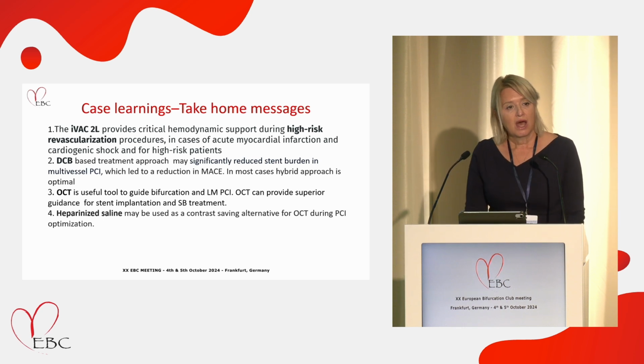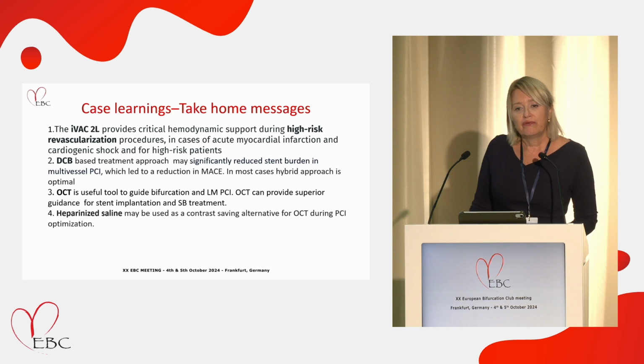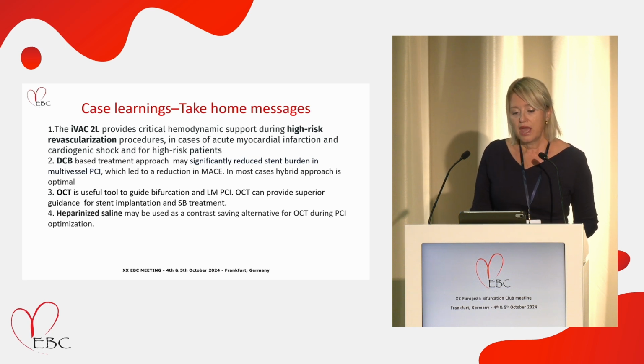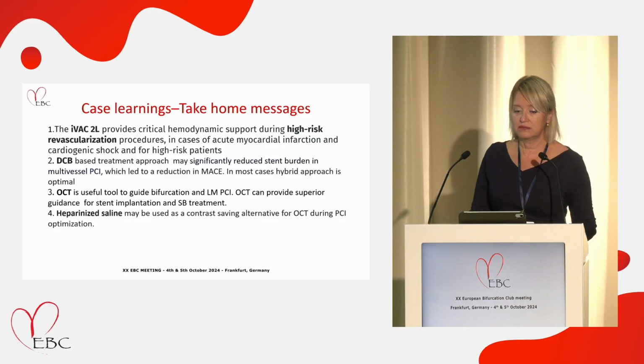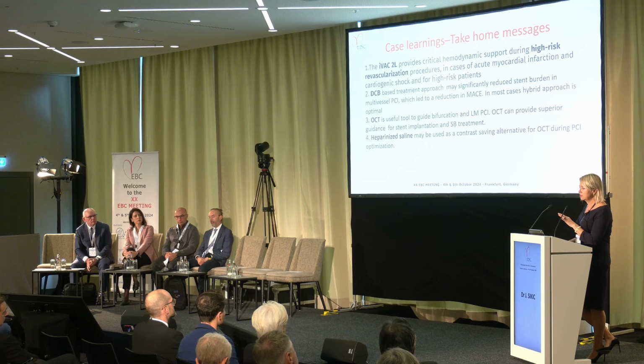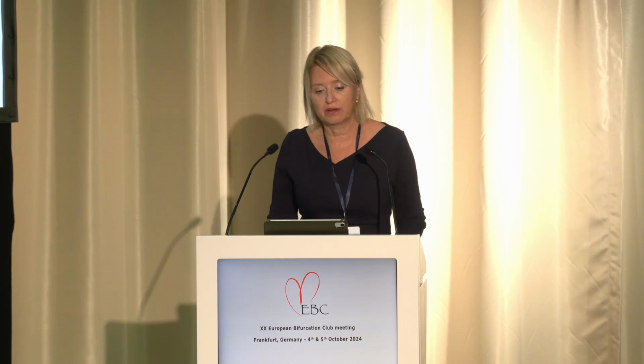Last year in Warsaw, we were talking about OCT, and we said OCT is a must in bifurcation lesions, so I did it. And I think also that OCT gives us lots of information, and it is proven also with this case, because you saw on the StentBoost that the stent expansion was excellent, but there is also a huge geographical miss.